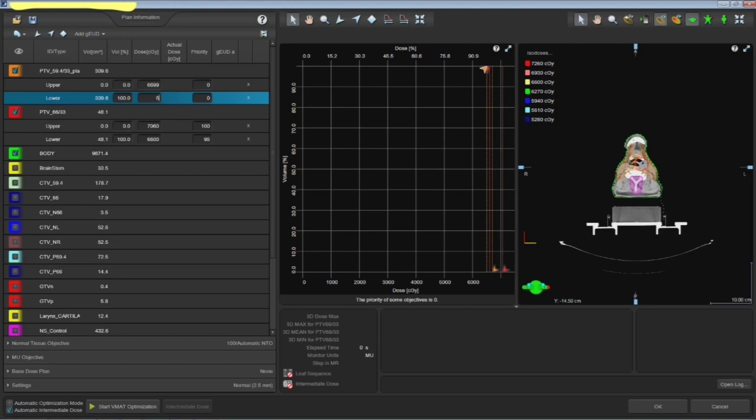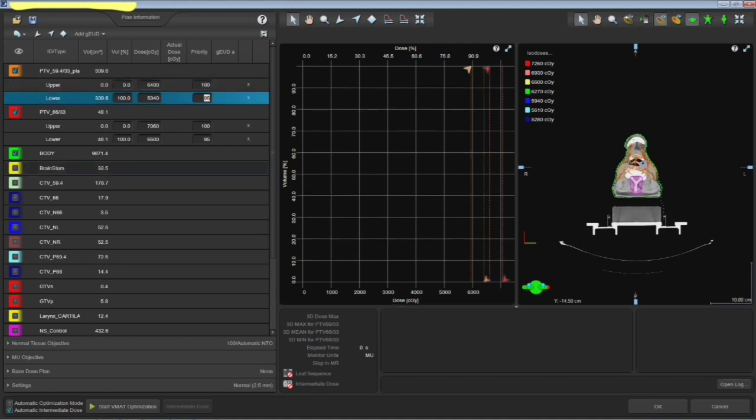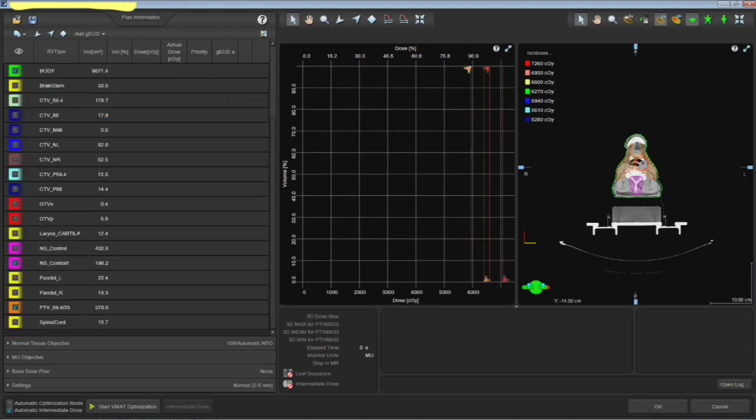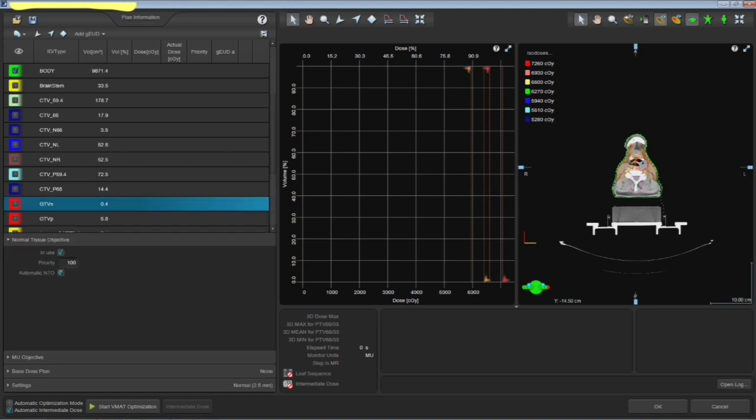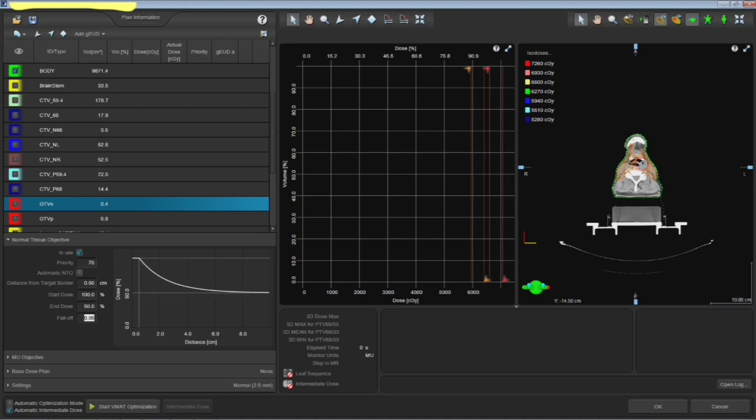By giving a more priority, it is well proven that your MUs are going to be more. Lots of papers. And another thing, this normal tissue, I feel that these values are working very good with me, for me.